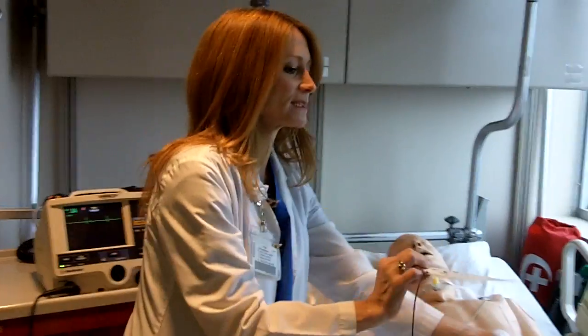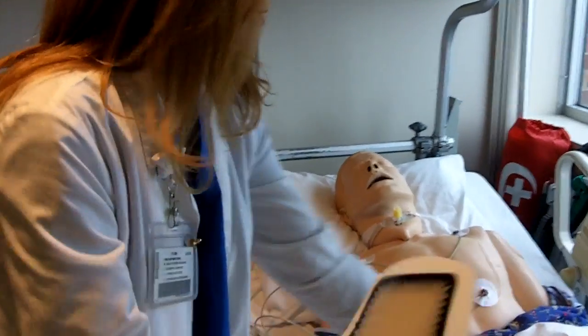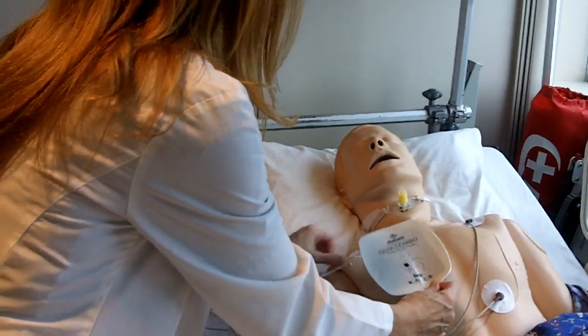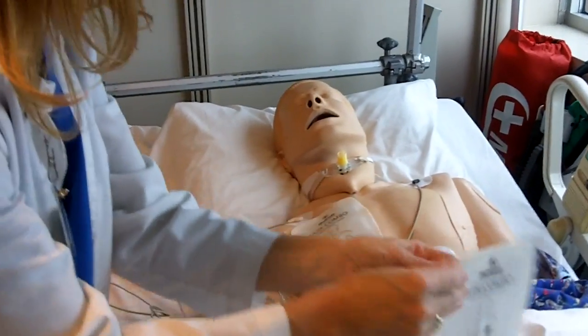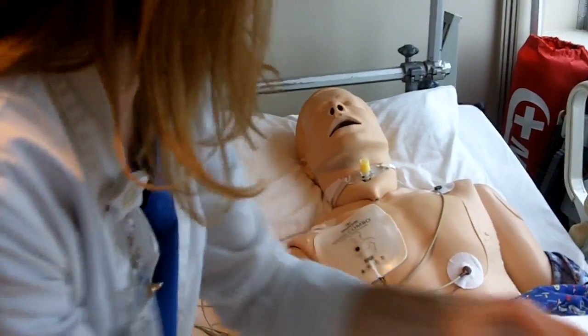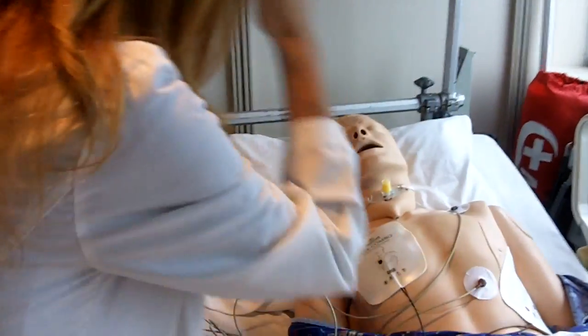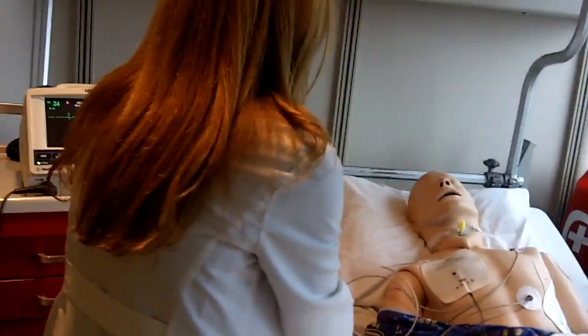The picture's on the pad, so it's simple to follow. I'm just going to peel the back part off and apply it to the right upper chest. I don't want to cover anything that is metal or any cuts. The other piece gets put on the left lower, underneath the nipple line.